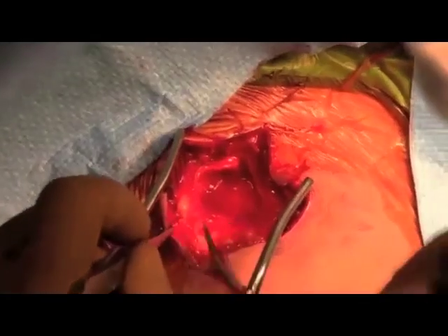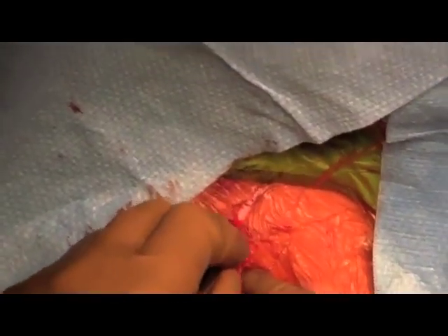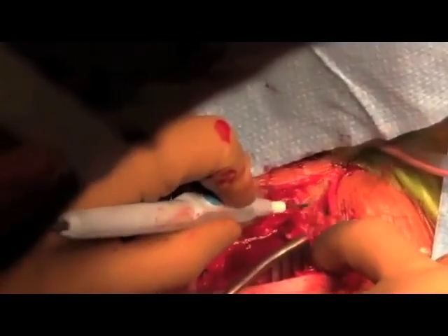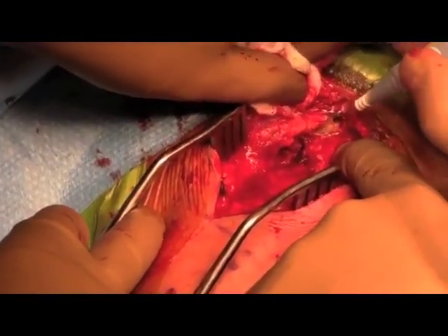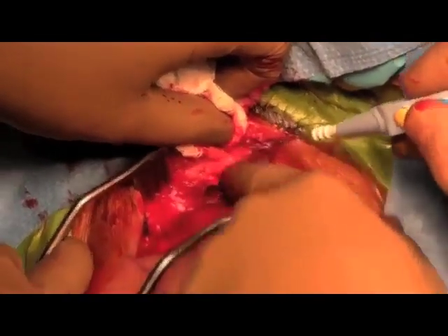The platysma is divided, and the interval fascia between the pectoralis and trapezius is identified. This interval is divided, and the soft tissue is elevated off the superior aspect of the clavicle. It is important to keep these flaps thick for later closure.